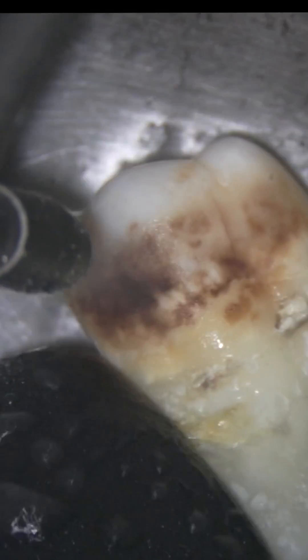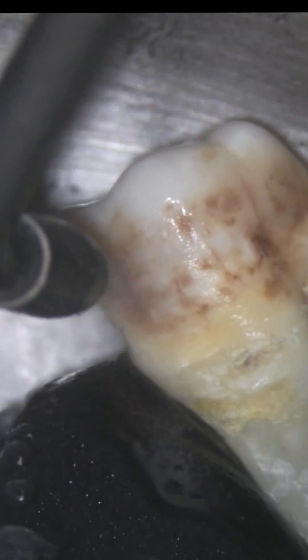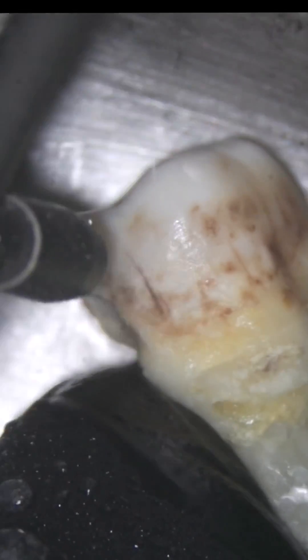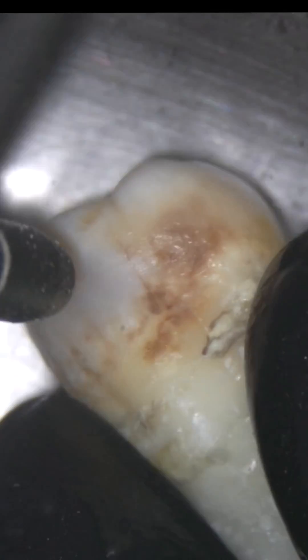So, now I will be demonstrating how it is used for cleaning the surface of the enamel here. You can see that it clearly removes the biofilm stains and makes the substrate more conducive to bonding.